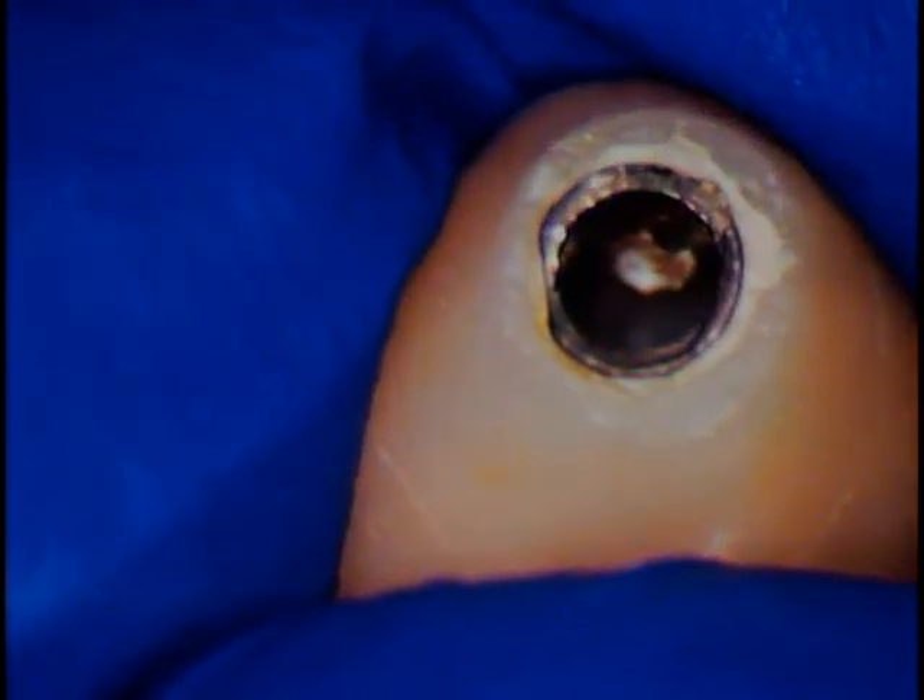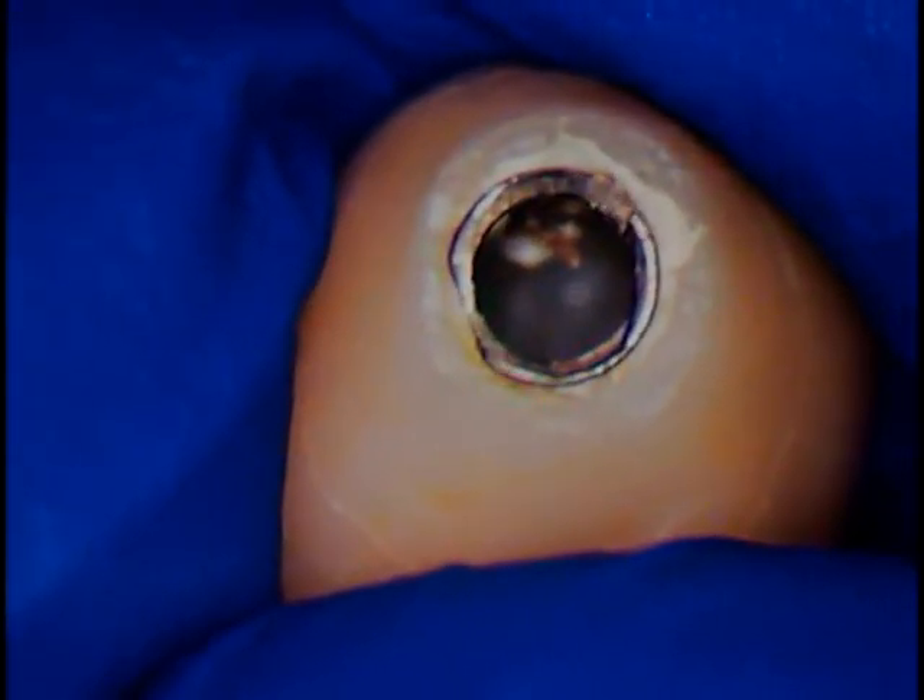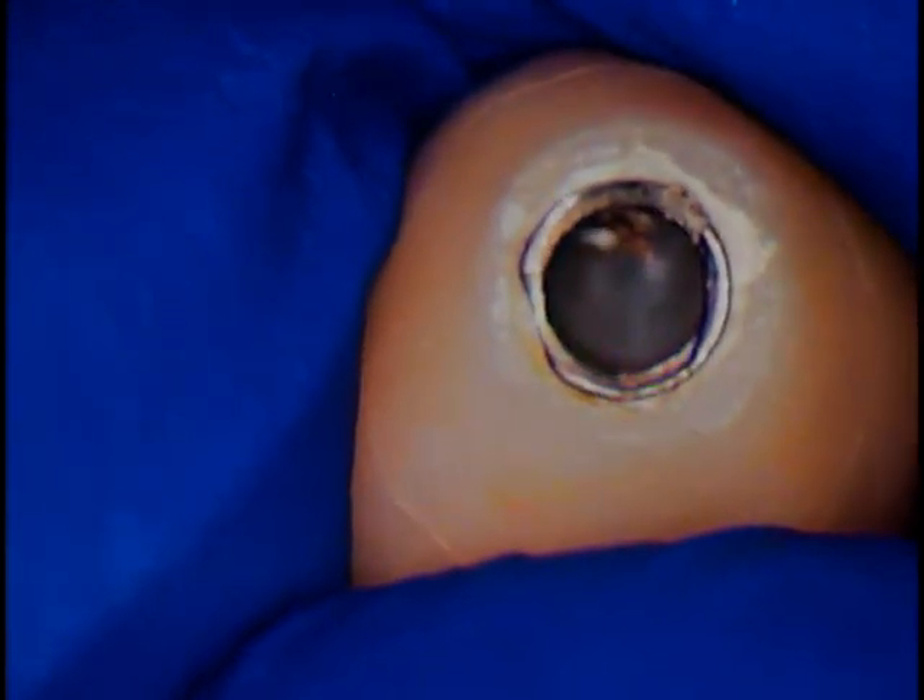Perhaps we're dealing with a cast component. It could have been a cast or it could have been just a prefabricated milled component. At any rate, this is the evidence we have on one end. In the mouth is the other.